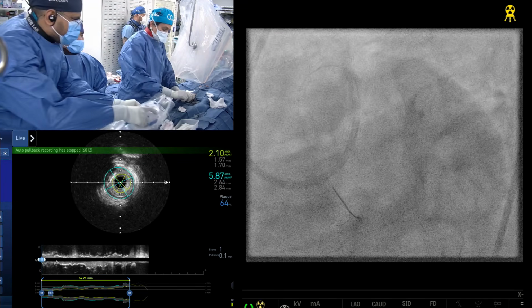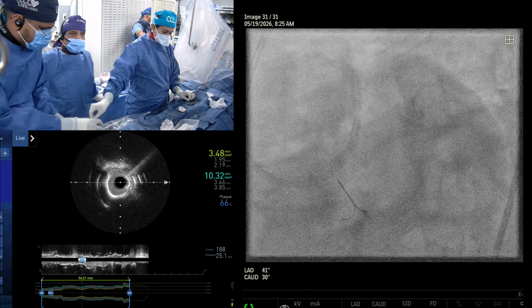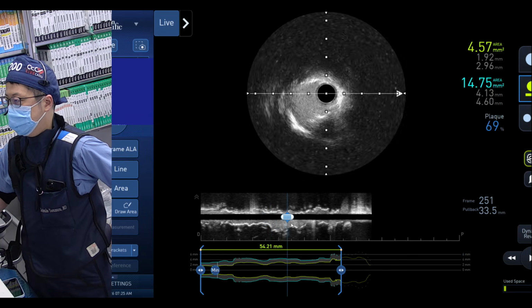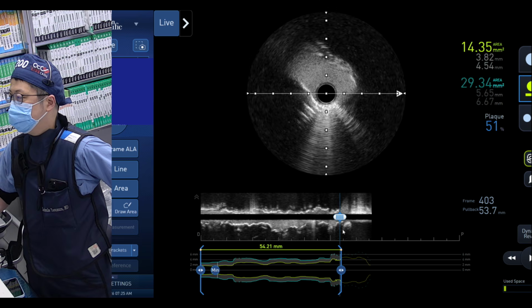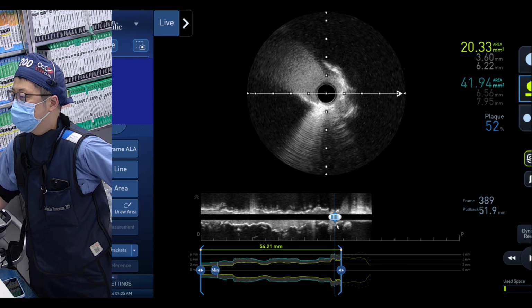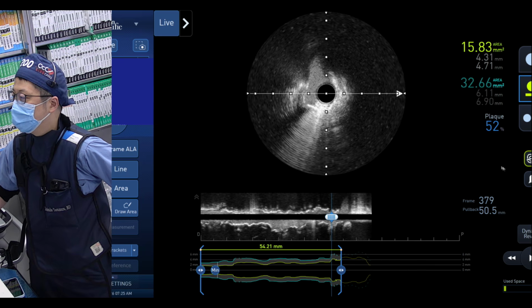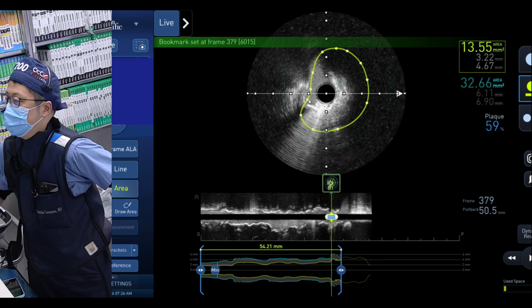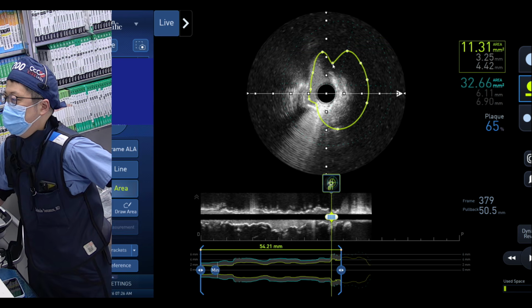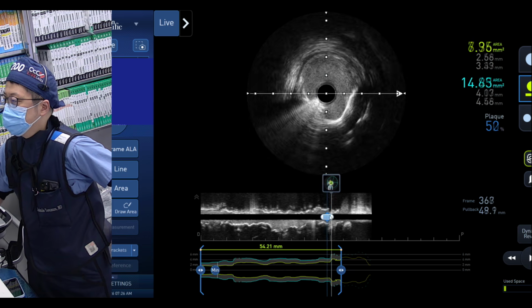Okay. Tell us, Kiski, exactly the lumen which we expect, the mid LAD full calcium circle. But tell us about the nodule at the ostial LAD, left main combination. Sure. Now this is the left main, and we see the circ from the 10 o'clock just inside this. So this is exactly the ostial LAD. It's very tight. But it does not look like any extra calcium, I mean nodule, right? There's no nodule. Eccentric calcium, Samir. Based on the imaging, we have to say it's just eccentric calcium. There is no true nodule.